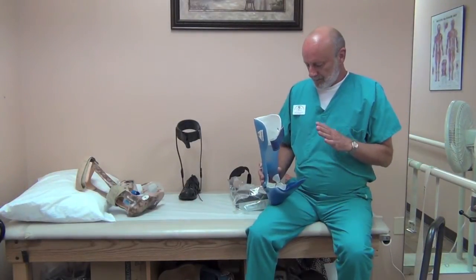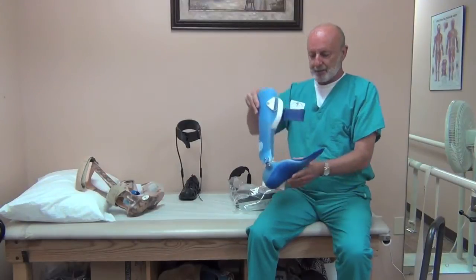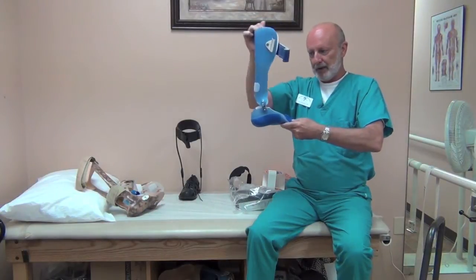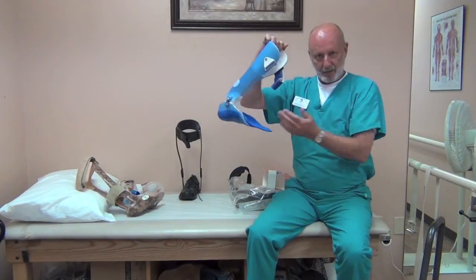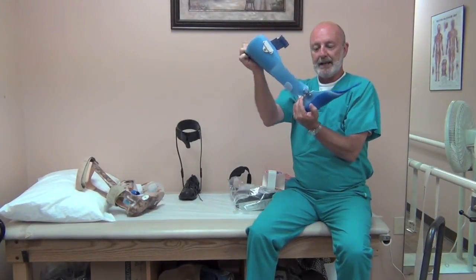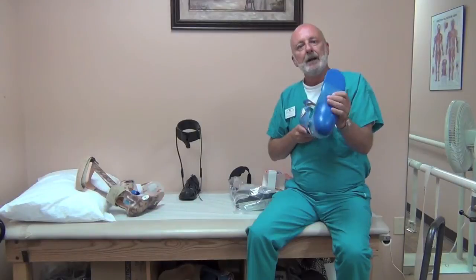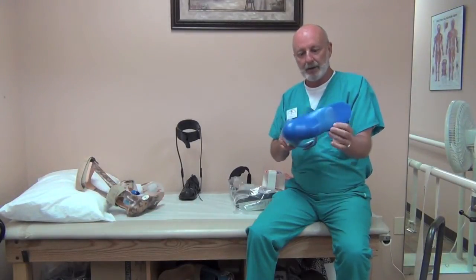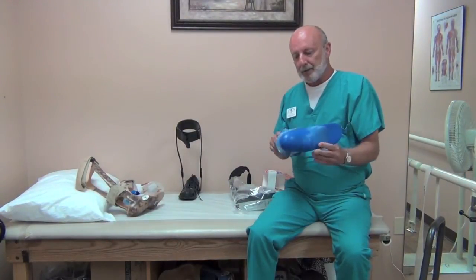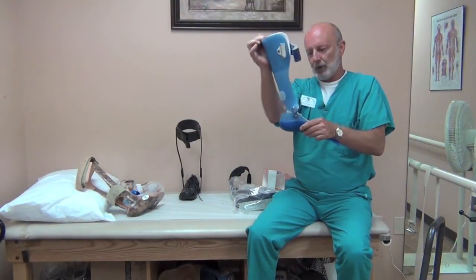The most common design we use is a simple hinged AFO with joints that spring the toe up, so that when the brace is weighted the leg can go through the entire range of motion. During the swing phase, when you have a tendency to catch your toe, it raises the toe up so that it clears the floor, and as soon as the heel hits the ground it will flex with you. This is a good design for driving because it allows full range of motion and you can effectively operate a gas pedal and a brake. This would be called a hinged AFO with free motion or full range of motion.